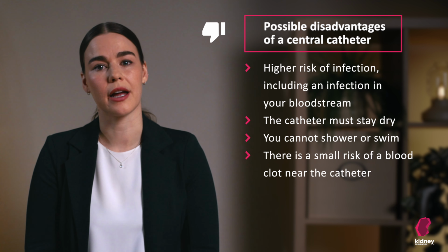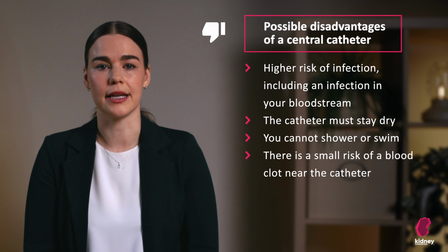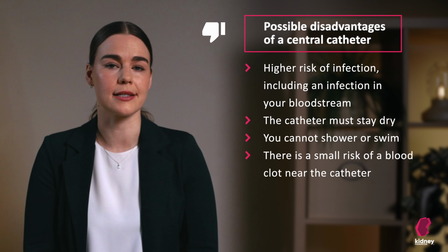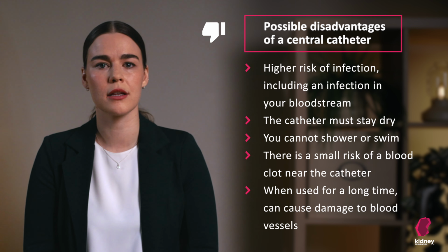There's also a risk of getting a blood clot near the catheter, but the catheter is filled with a special fluid at the end of each treatment to make this less likely. If the catheter is in place for a long period of time, it can cause damage to the blood vessel.